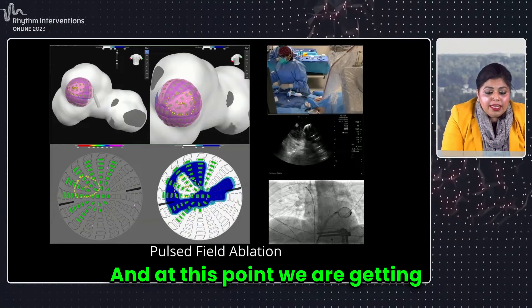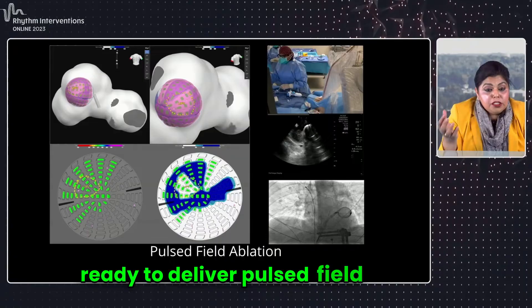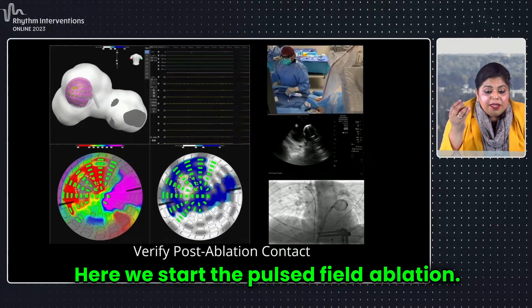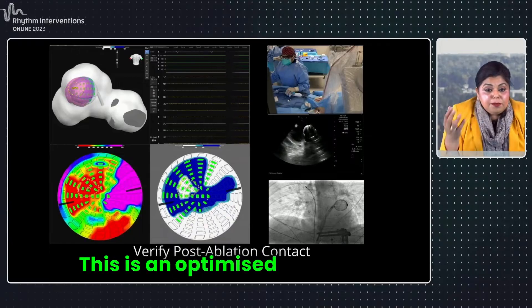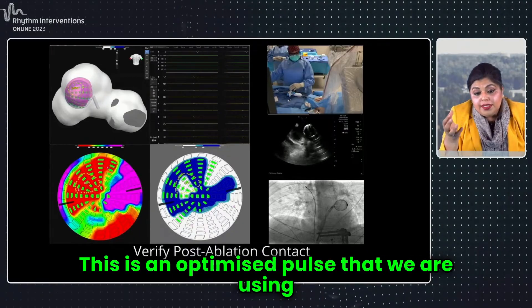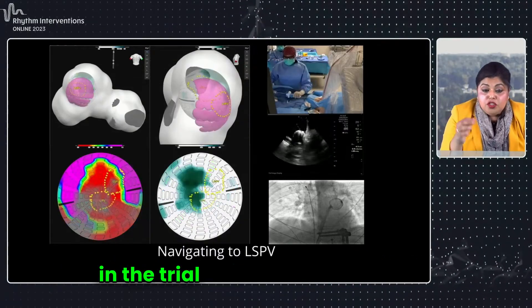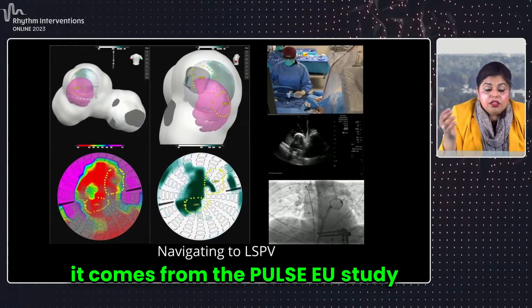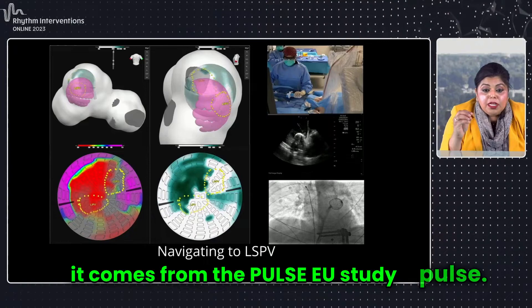At this point, we are getting ready to deliver pulse field ablation. Here we start the pulse field ablation. This is an optimized pulse that we are using in the PulseSol trial, which is what was studied, and it comes from the PulseEU study. So here we are using the optimized pulse.